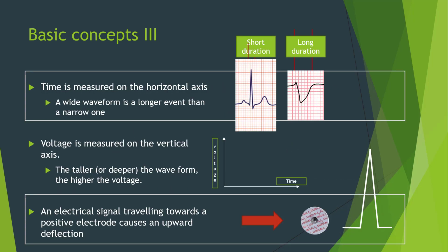The vertical axis on the ECG paper reads voltage, and so the larger the size of the waveform, the greater the voltage that has been captured. The horizontal axis measures time. The printer runs at a standard speed of 25 millimeters per second, and the divisions on the horizontal axis of the paper are a very accurate indication of how much time any waveform has taken to complete.